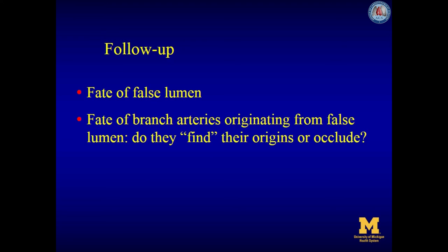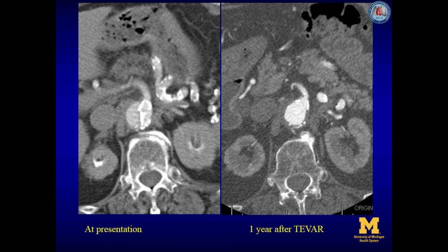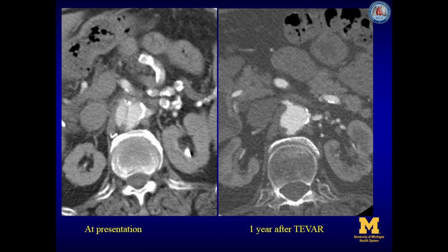During follow-up, it is important to evaluate the false lumen and the branch arteries originating from the false lumen. The collapsed true lumen at the level of the origin of the superior mesenteric artery at presentation is marked by the atherosclerotic intimal calcium, and the true lumen is completely re-expanded one year after TEVAR. At baseline, perfusion is seen in both true and false lumen, and one year after TEVAR, perfusion is seen only in the true lumen, with well-perfused kidneys.